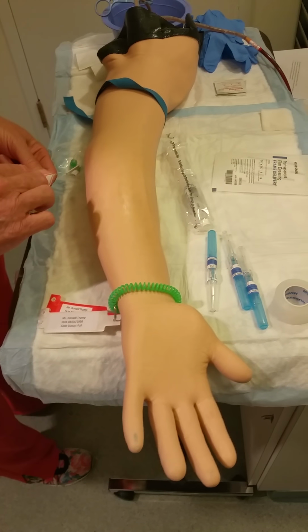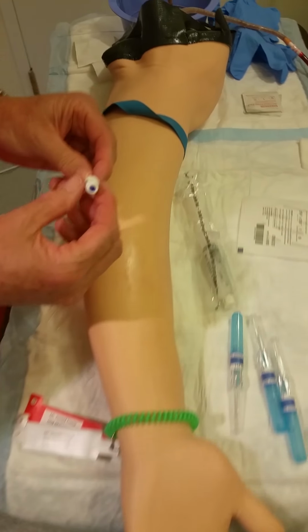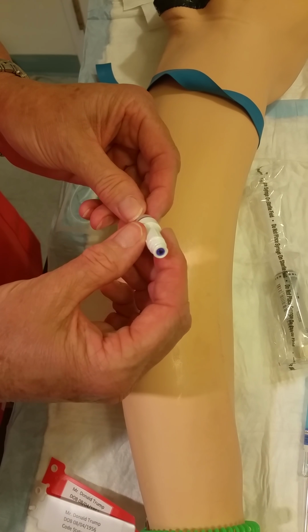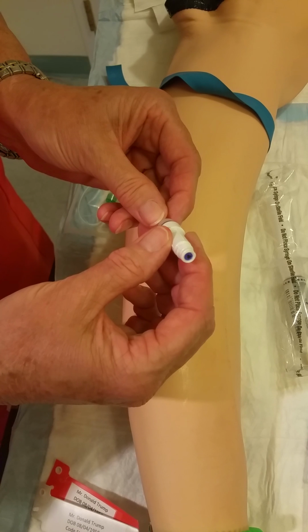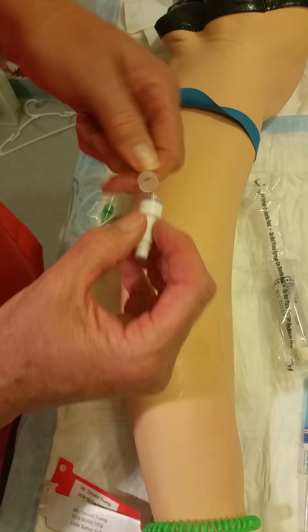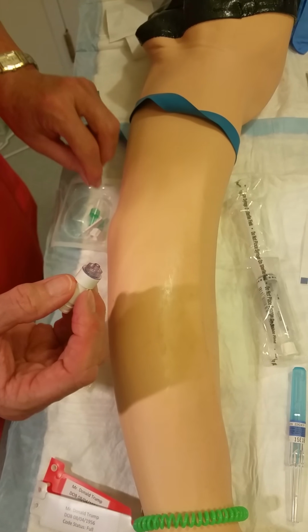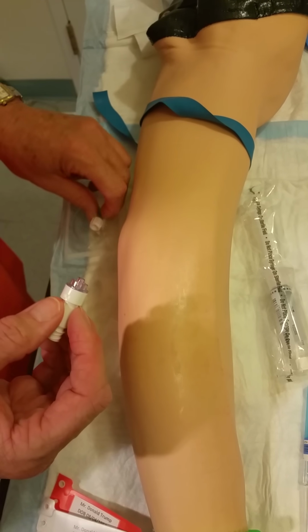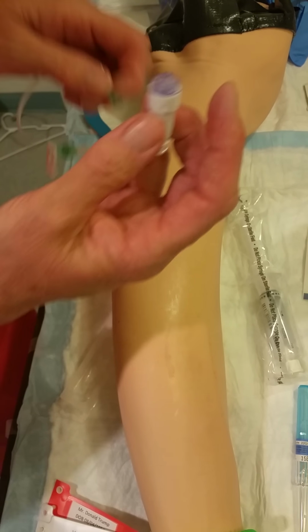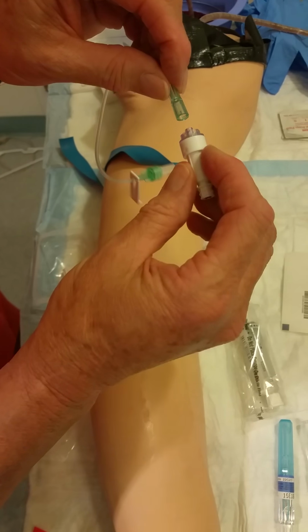My injection valve has a male end and a female end. The female end is blue. That's where we'll attach our saline flush, and that is where the infusion tubing attaches. So that means I have to attach my extension set to the male end of the device. Fortunately, there is a female end of the extension set, and they go together.